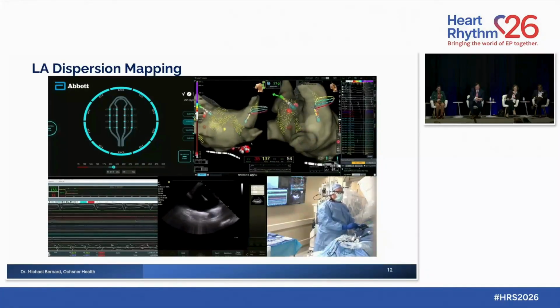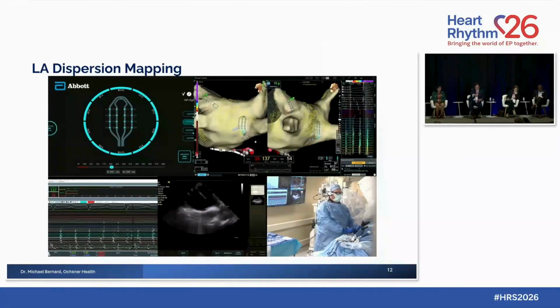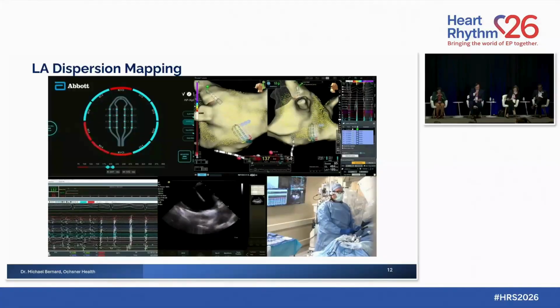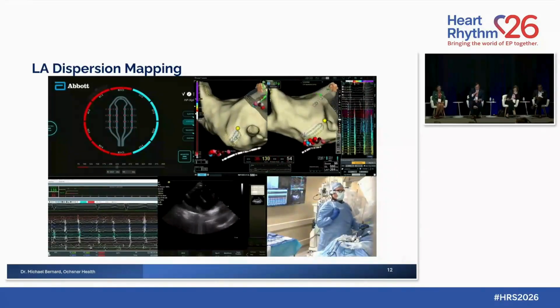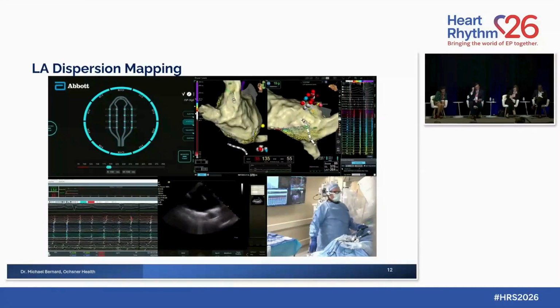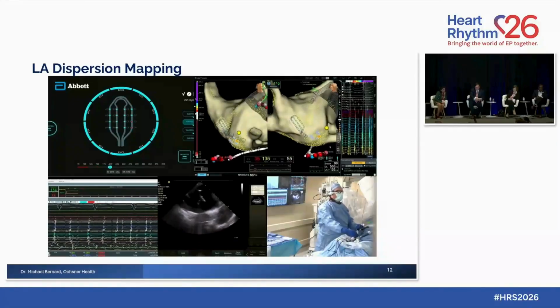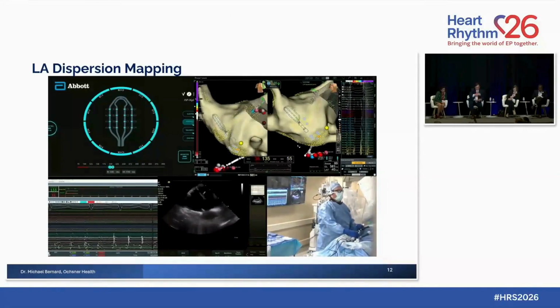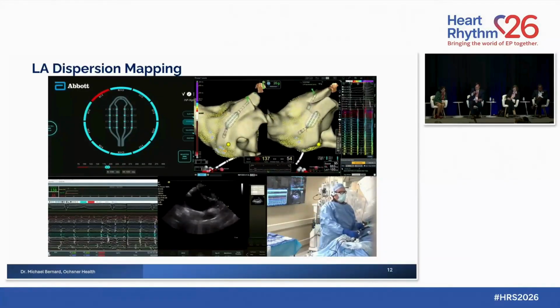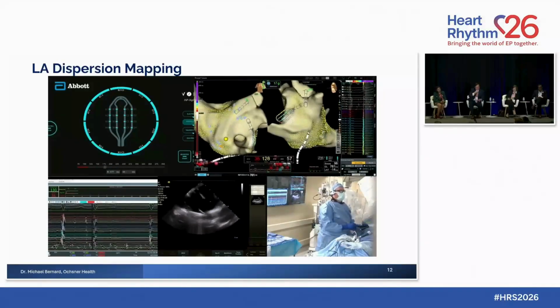We have temporal dispersion up on the appendage. So we have some dispersion here in the low posterior wall, RAPV. We then had dispersion, there it is again. We had dispersion in again, low left atrial septum again. And we had left superior vein appendage base roof connection temporal dispersion there. So our tags were at that junction, posterior wall and low left atrial septum.